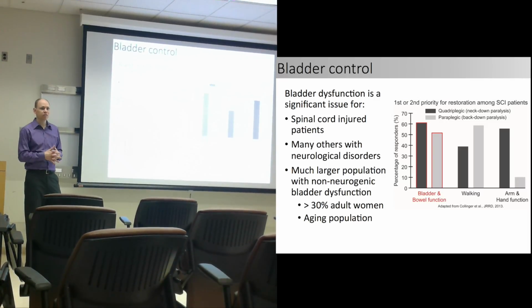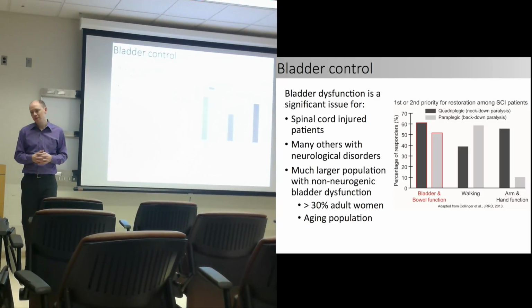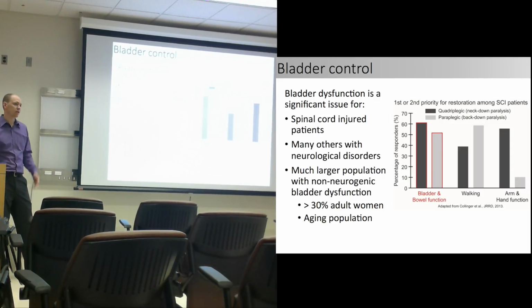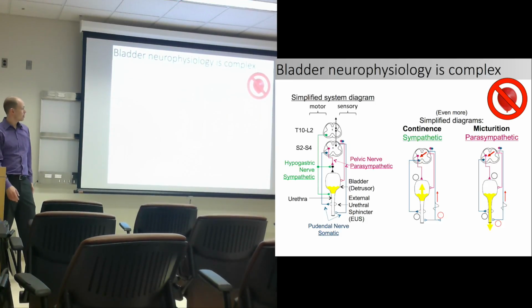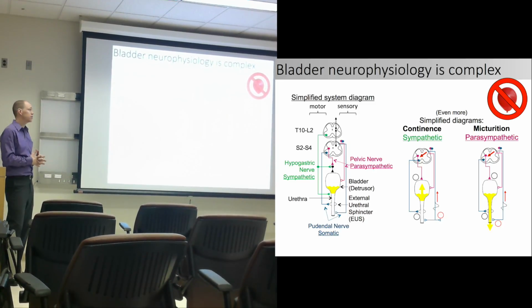There's a variety of drugs that have partial efficacy, and mechanical devices like condoms or diapers are going to be messy or uncomfortable. So ultimately, as the last-ditch effort for some individuals, we have neurostimulators or devices implanted to provide assistance. So this may be too basic for a lot of people, but I like to throw in this talk a little about the neurophysiology because the complexity of it made designing devices fairly challenging.